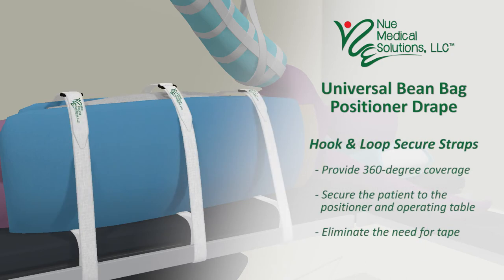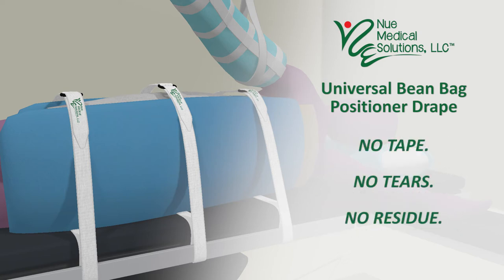3 hook and loop secure straps with 360 degree coverage safely secures the patient to the positioner and operating table, eliminating the need for tape. No tape. No tears. No residue.